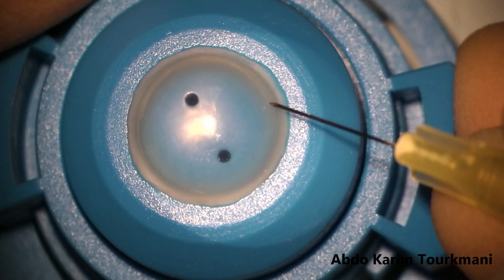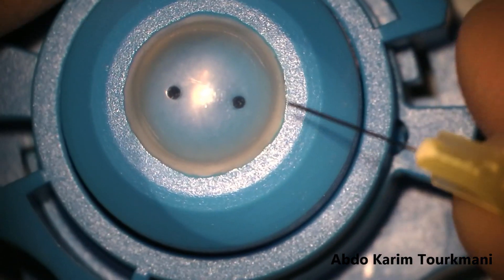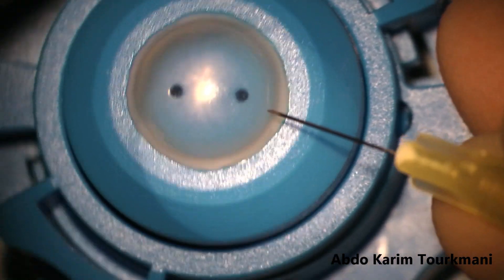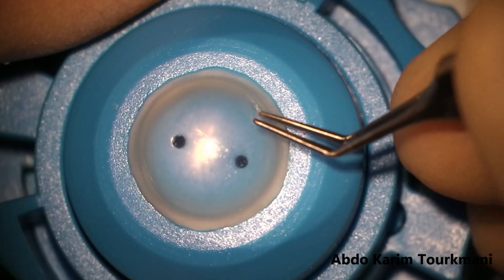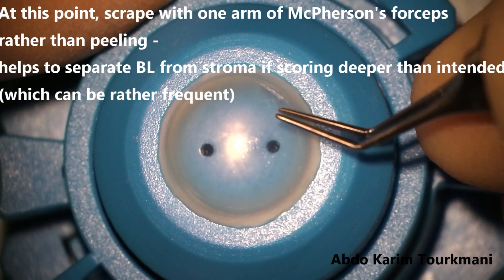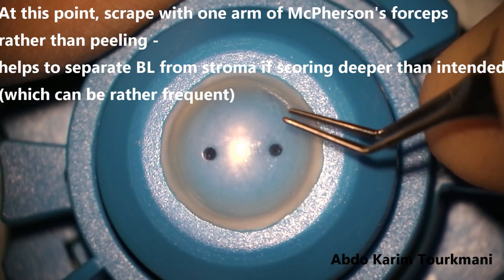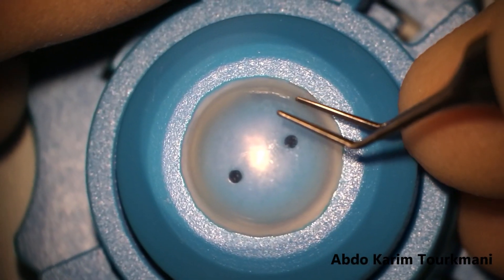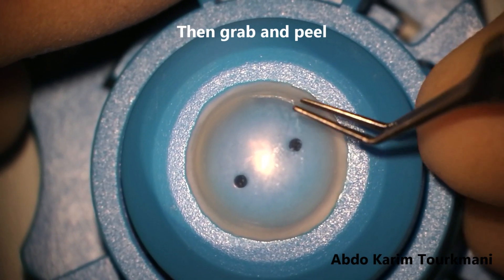And I continue doing the scoring 360 degrees as per the original technique. At this point, this is my first modification. Rather than straight away trying to grab and peel with a McPherson's forceps, what I do is I do those gentle strokes or scraping movements with just one arm of the McPherson's forceps to try and lift the Bowman layer alone.